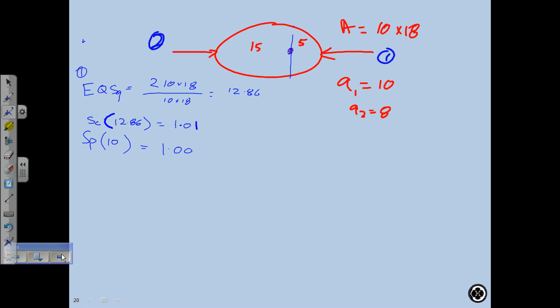Okay, TMR for what field size? The 10. TMR depends on phantom scatter. Okay, and that's 10. What about depth? 5. 5, okay. So can somebody look that up? It's 0.966. Okay. Are we ready to do our MUs?